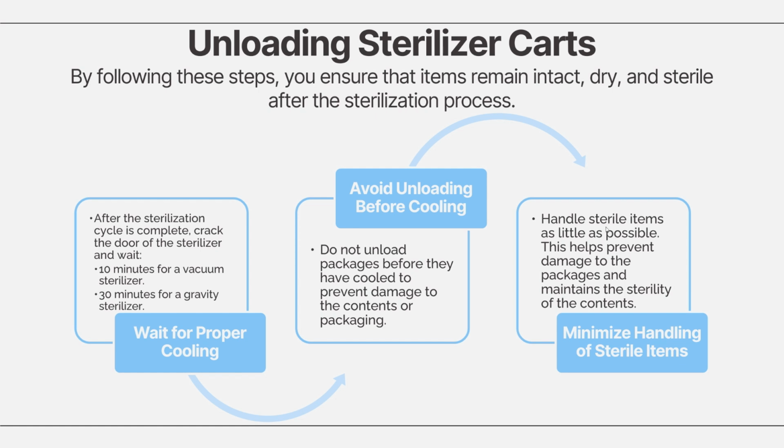And when you do unload, minimize handling sterile items. Excess handling risks tearing or damaging packaging, which could expose sterile devices to contamination. So you have to handle packages gently and as few times as possible, always following proper aseptic techniques.